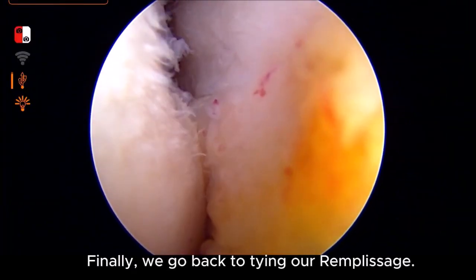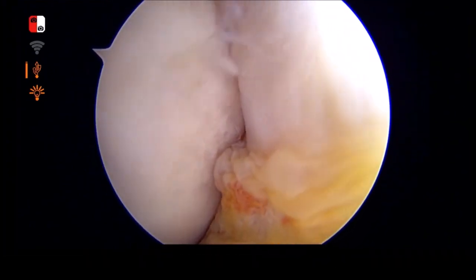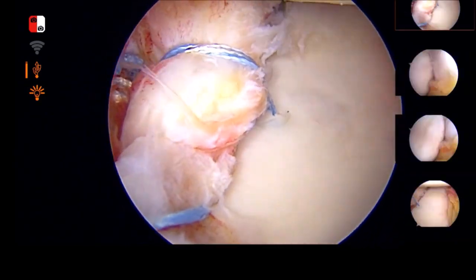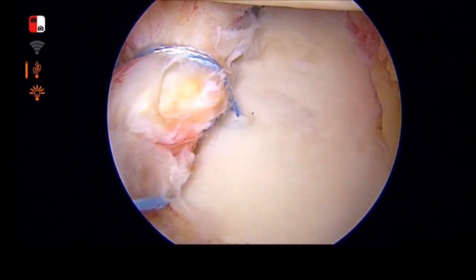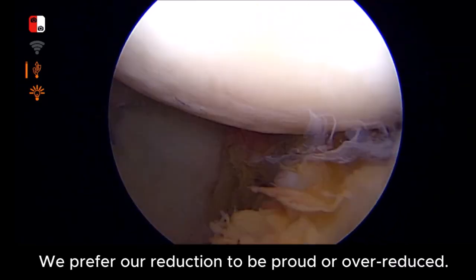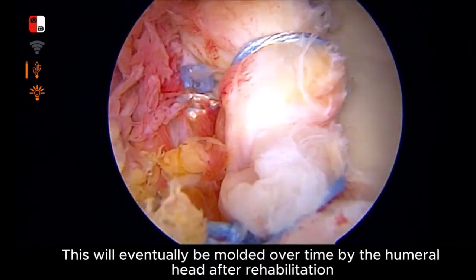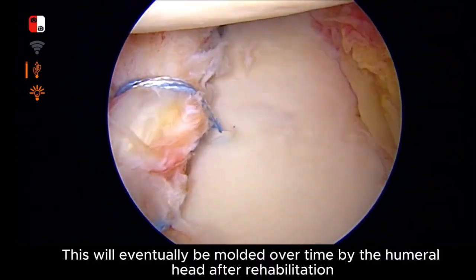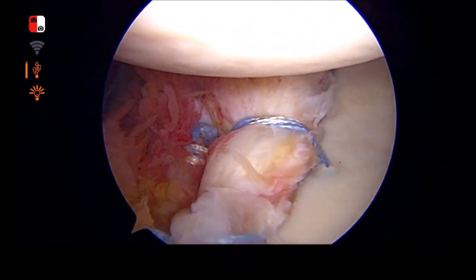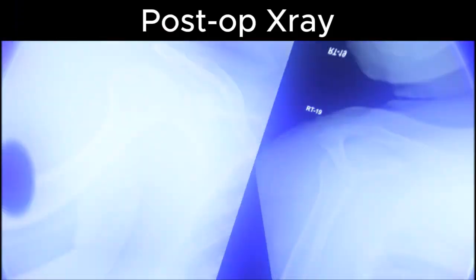Finally, we go back to tying our remplissage. We prefer our reduction to be proud or over-reduced, because this will eventually be molded over time by the humeral head after rehabilitation.